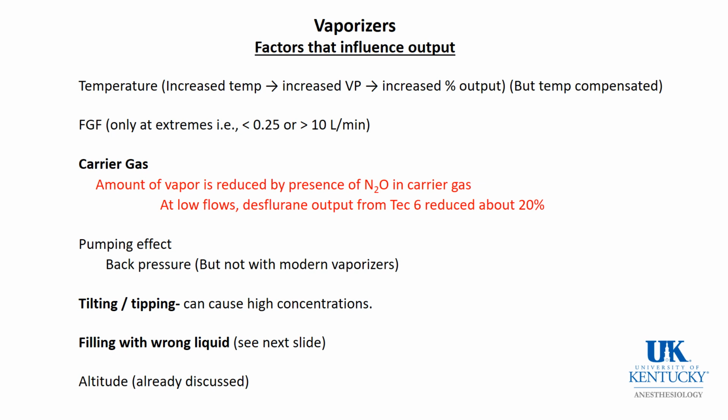One thing that a lot of people don't appreciate is that carrier gas does affect the performance of vaporizers. And nitrous oxide will reduce the vapor pressure, and at low flows, nitrous oxide will lower the output of the desflurane vaporizer.